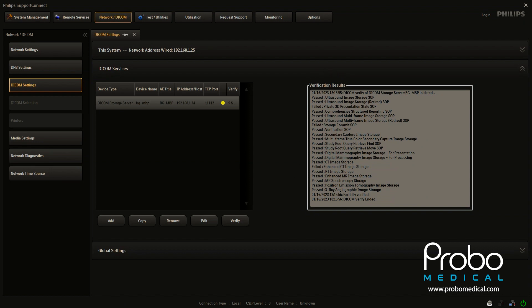If it failed everything, there would be nothing in this box. It would be blank, and you would have a red X. So at this point, this is ready to go. And that's how you enter a DICOM device on the Philips Epic.